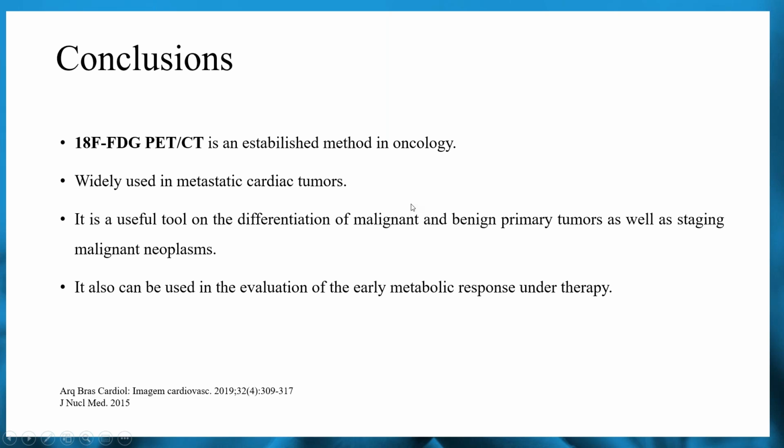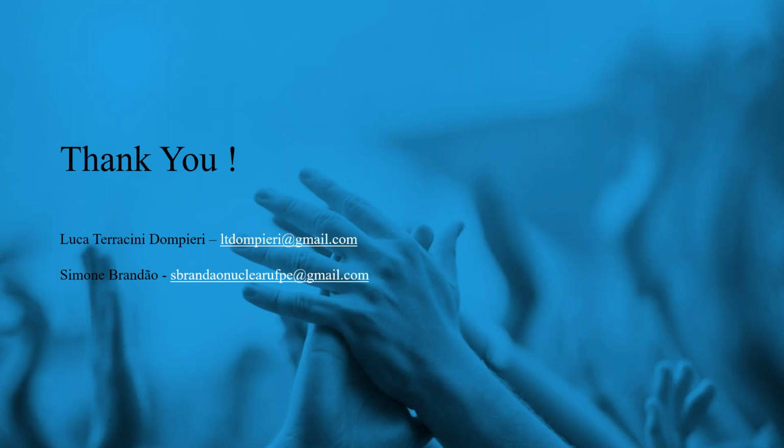So after all that's been said, I think the FDG PET-CT showed its value in the diagnostic approach to cardiac malignancies, and I think it cannot be ruled out of any diagnostic algorithm of cardiac tumors.